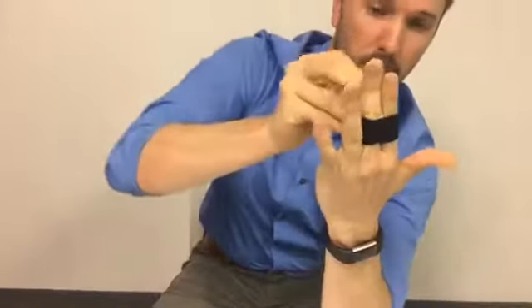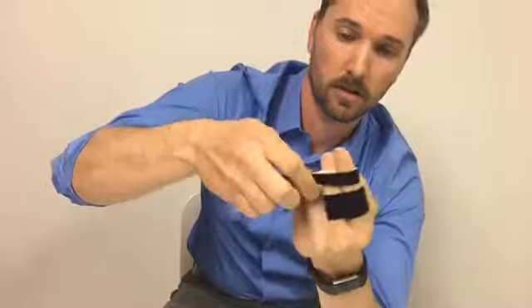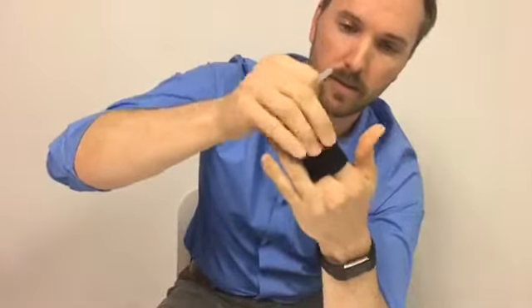The last thing you can do is use multiple Buddy Loops on your fingers to get maximum support. In this case, I'm going to put a one-inch on the base of my index finger and simply wrap around, then take a half-inch and wrap it around the top. As you can see, this gives a really nice support around the index finger. You can use two of the same width or two different widths — it just depends on what type and how many Buddy Loops you have.